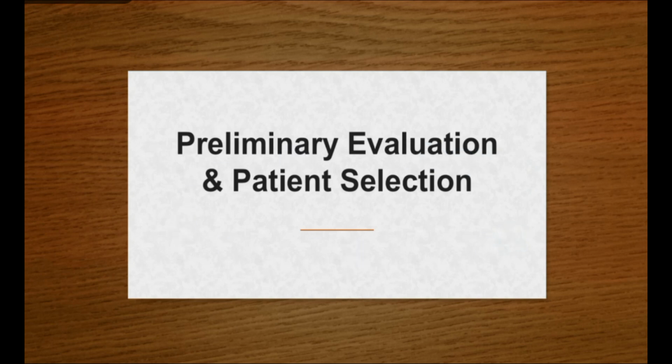Okay, so patient selection is very important. First, before going to the pre-fitting assessment, I want to explain patient selection. The importance of patient selection is that if you prescribe the contact lens to the wrong candidate, it will be harmful for the patient.